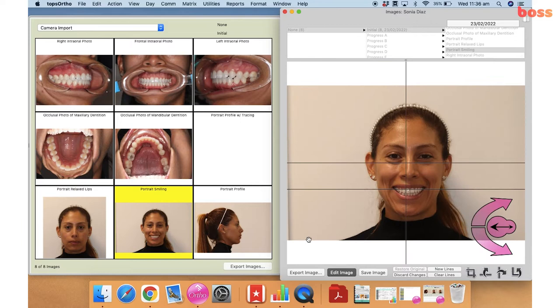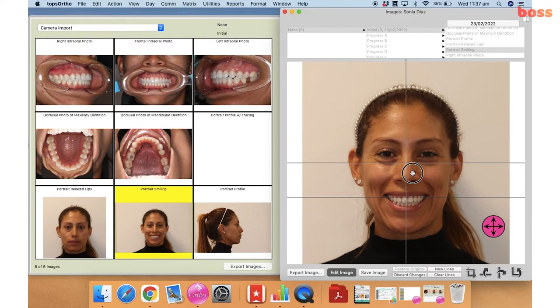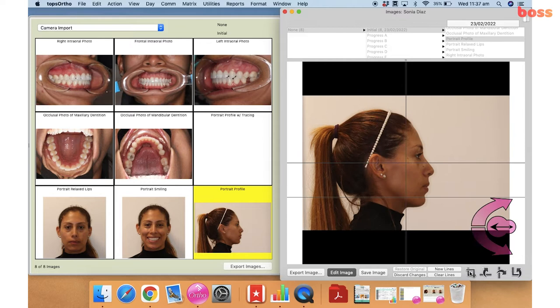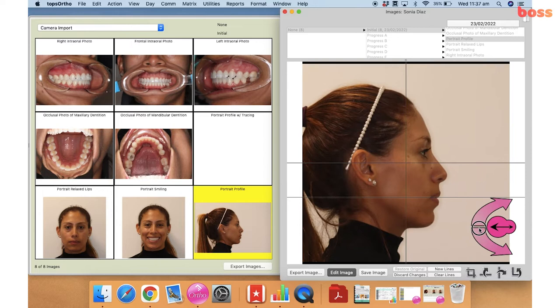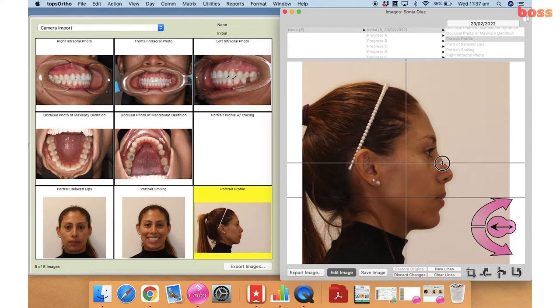Again I'm going to do the same thing — square the photograph, zoom in, and adjust it so the center of the nose is in the middle of the frame. Again you can see both ears are equally projected. It's important to make sure as well, when you're taking the portrait profile, that the patient is resting and their eyes are looking straight ahead into the distance.